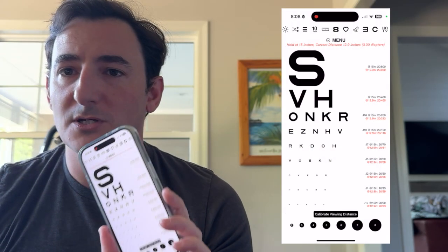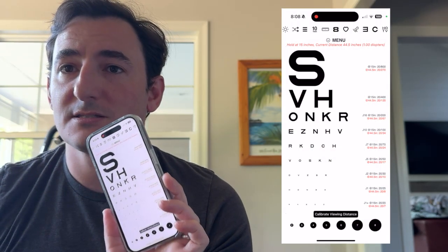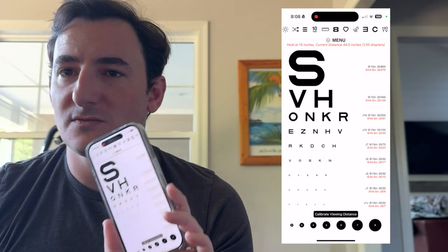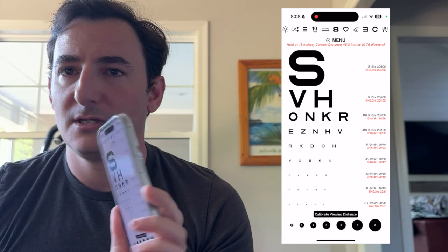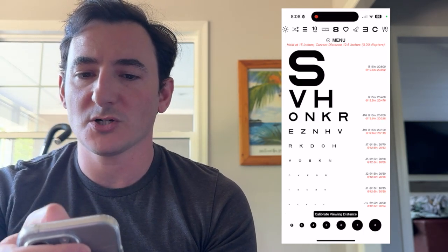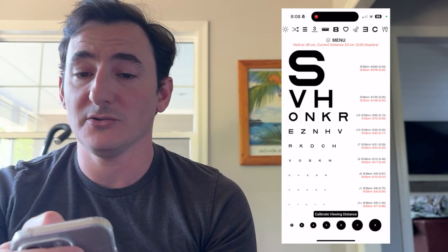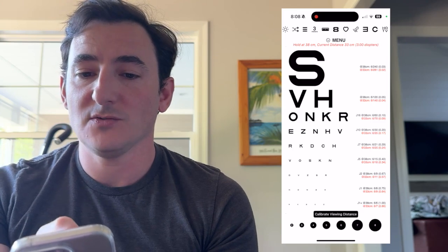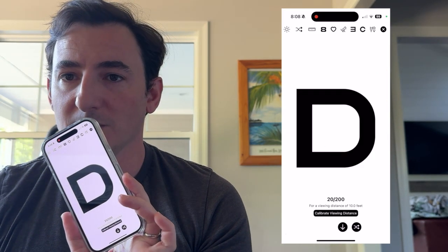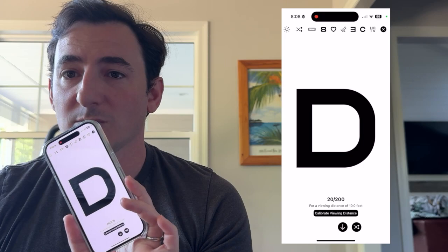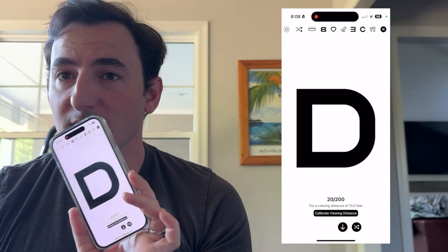In this video I'm going to show you how to test distance vision using the iChart app. On the navigation bar there's a 10-foot button, or if metric mode is enabled it'll say three meters. If you tap this button you're presented with a single optotype that is calibrated to 10 feet.